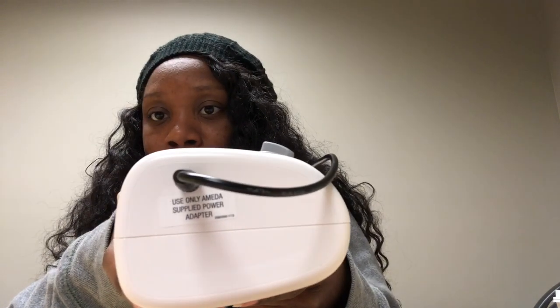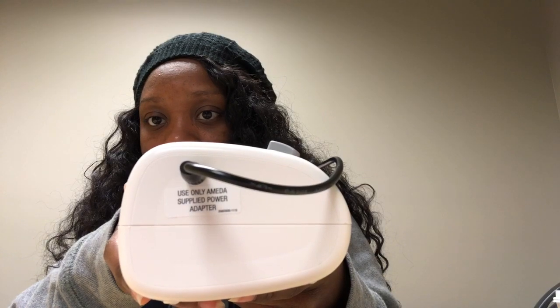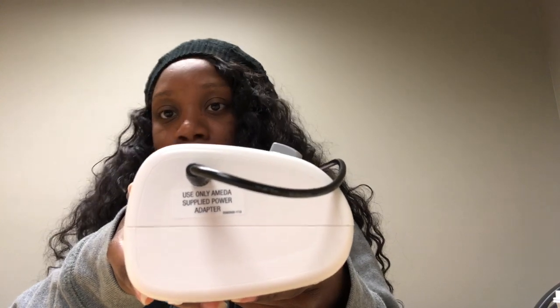And does it have a portable car charger? I don't know. I haven't looked that up really. And I wouldn't suggest using any other brand, like the Spectra, for example, because it specifically says here on the side, use only Ameda supplied power adapter. So I would not use that.